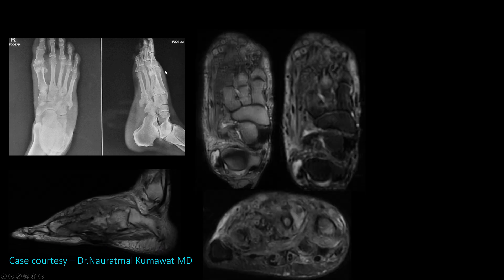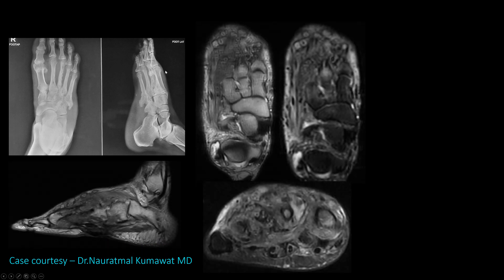You can see there is sclerosis and irregularity of the metatarsals, with bony erosions, but absence of soft tissue swelling over the foot. The patient was referred for MRI. On MRI, there is irregular sinus tract thickening, marrow edema in the bones, and a hypointense central area surrounded by a peripheral hyperintense rim.